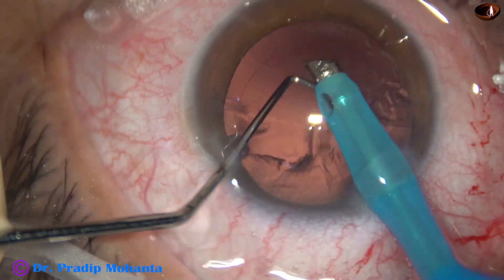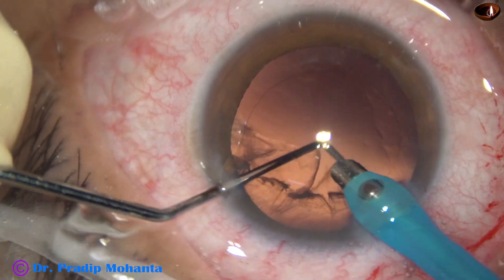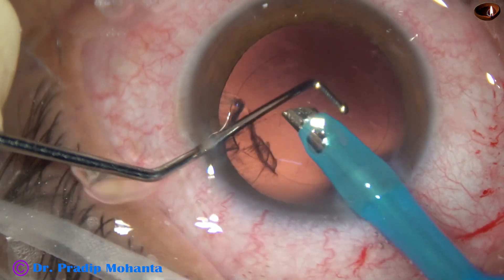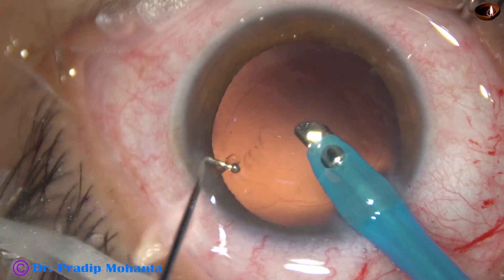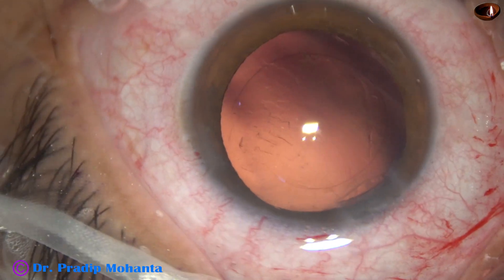Now I am removing the cortex by the handpiece itself. The ball-tipped irrigating cannula is protecting the posterior capsule. Cortex has been removed.